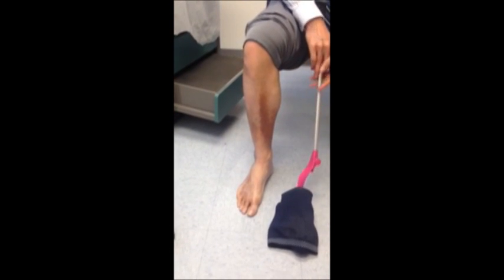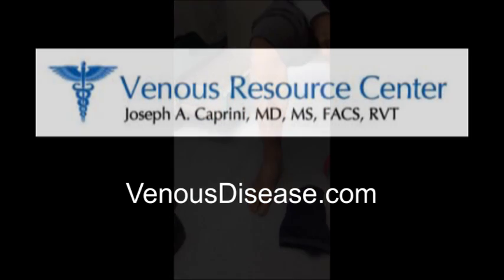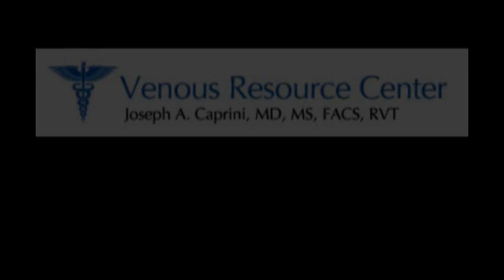And as you can see, it's a very simple process to remove the stocking.